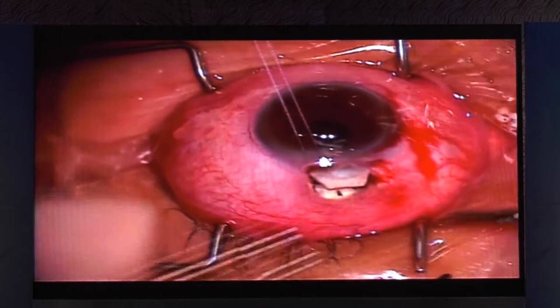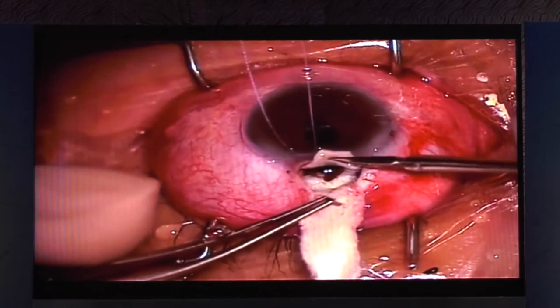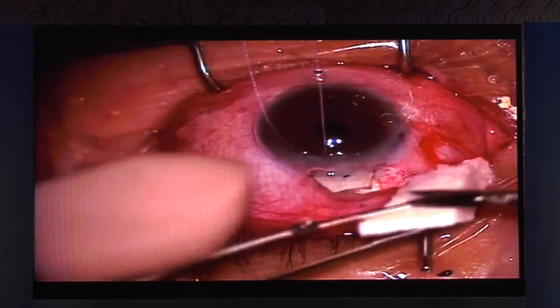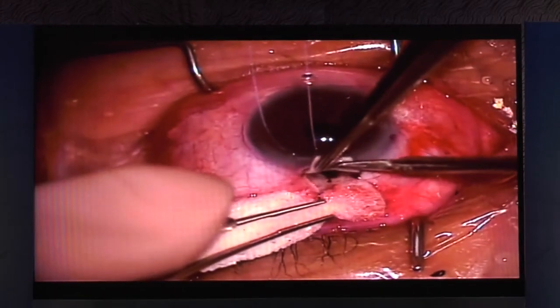So what they did was they used viscoelastic to push back some of the vitreous. They did an anterior vitrectomy to keep it as clear as possible. These cases tend to have a higher failure rate, okay? So, of course, the treatment for this is to avoid it. But if this happens, do a manual good vitrectomy, ensure there's no more vitreous presenting at the sclerostomy site.